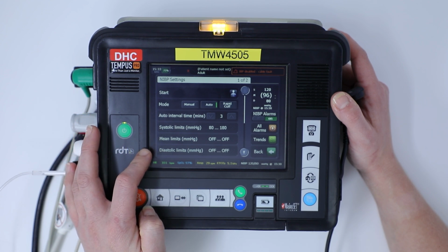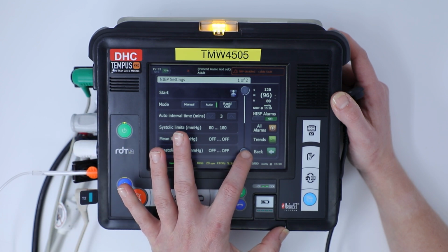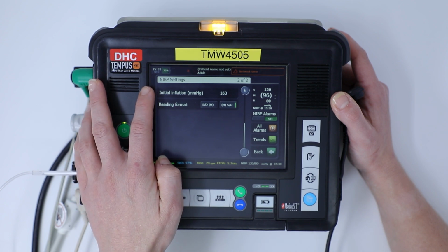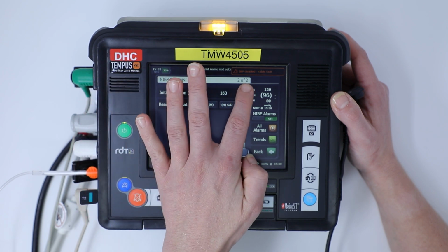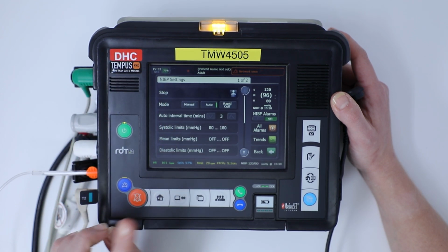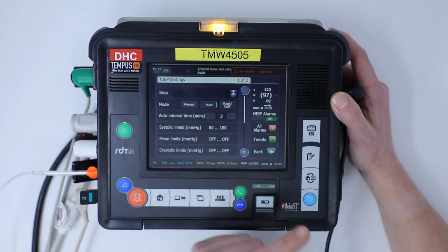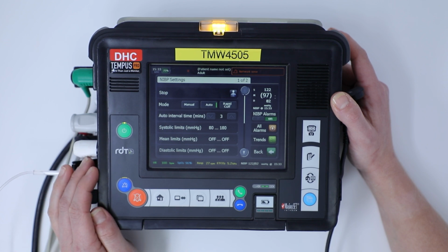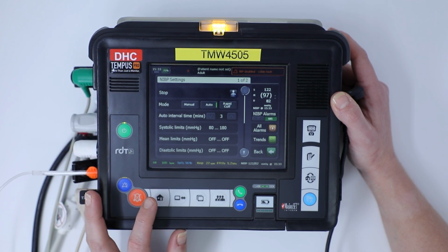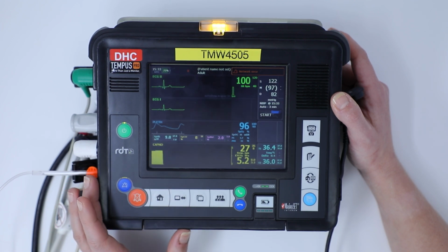It's going to give us our alarm parameters as well, whether we want to set it by systolic, mean or diastolic, 1, 2 or all 3. And it's going to give us the option to change the initial inflation pressure and the reading format. So we can just cycle the blood pressure and you can hear it kick in. And if at any time you want to stop it, you just click stop. If not, it will complete the cycle and measure the non-invasive blood pressure of your patient. Once that's complete and you're happy with your settings, click the home page button and it will take you back to your vital signs.